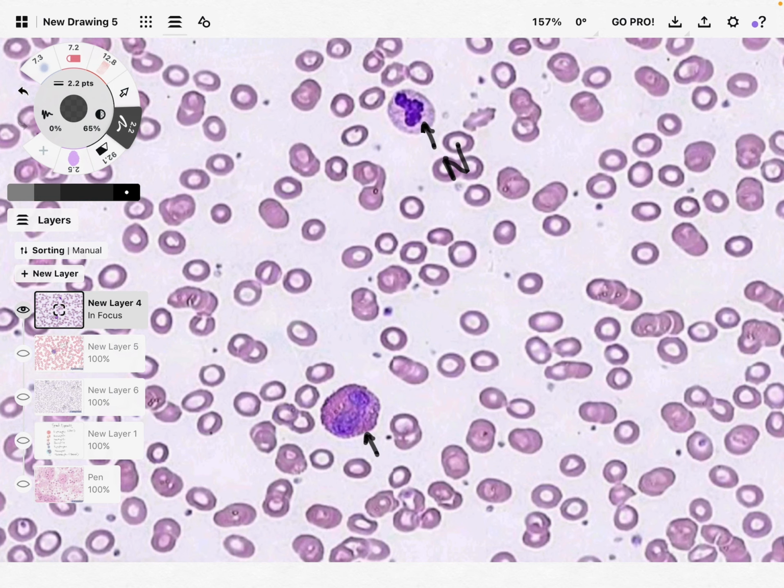So this other one, as we can see, does it have vesicles that are basophilic, like we saw with our basophil? So lots of really dark, round, even thick, round circles, vesicles, granules in this cell? Or does it look more pink, more reddish, more orange color? So hopefully everybody was saying, it looks more pinkish, reddish, orange color. Well, it looks more like a weird dark pinkish color. So this is definitely an eosinophil.